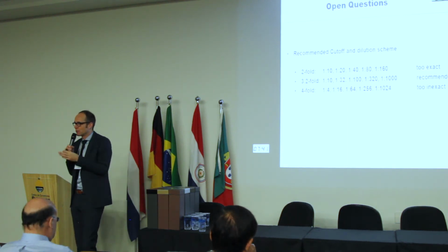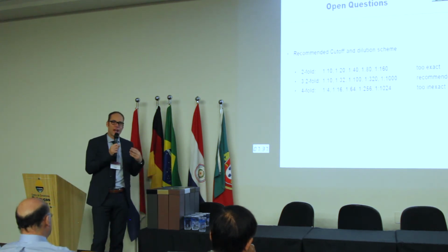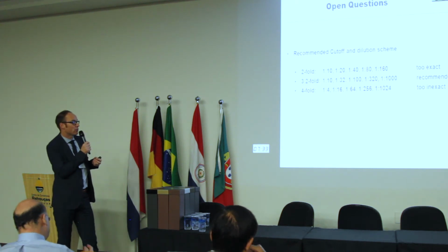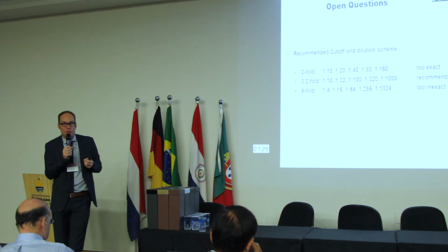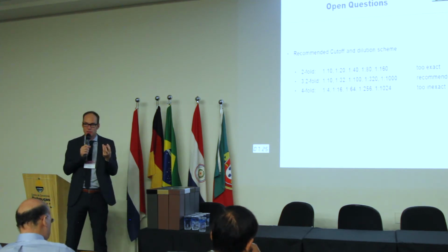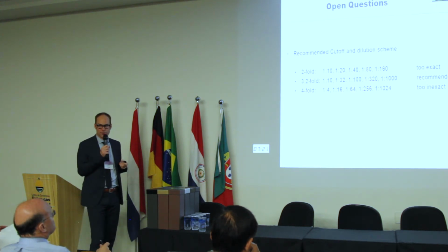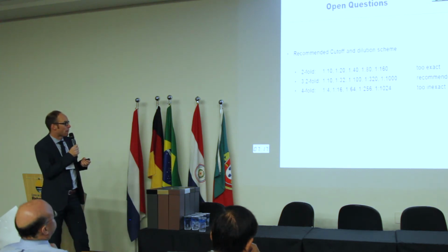And Luis Andrade showed that patients normally have a higher titer compared to healthy controls or healthy blood donors. And also the pattern is important, because the fine speckled pattern, in a low titer, maybe is not as significant as a homogeneous pattern, for example, or a centromere pattern.